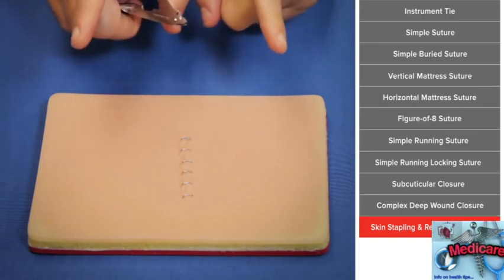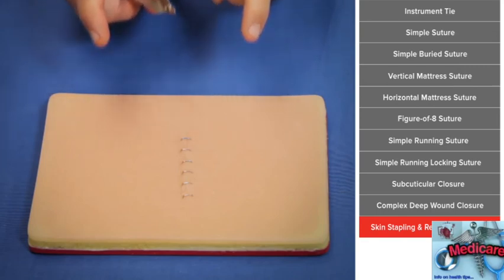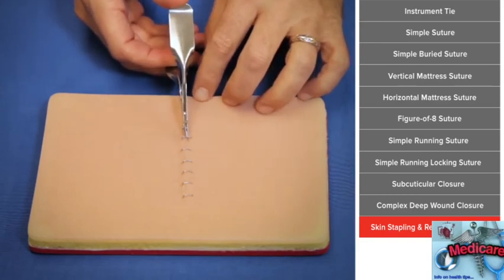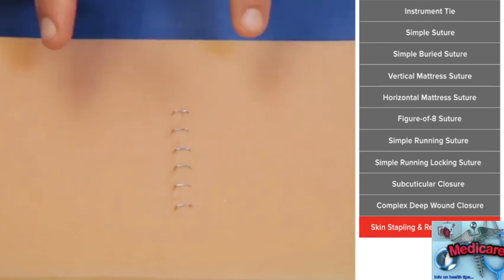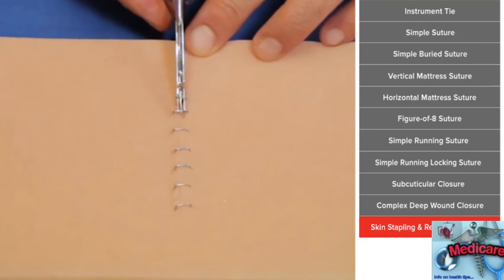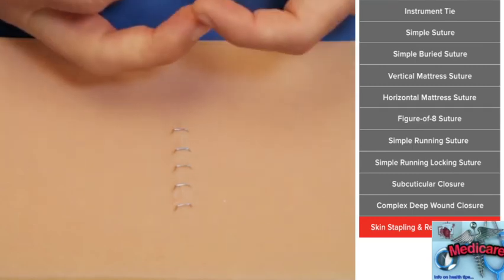Well, how do we take these out? This is a staple remover. Basically, it'll grab the staple, which has turned its edges in to approximate, and will open the edges of the staple, and then it'll straighten them so they pull right out. And so here you see as you push down on the staple remover, it unbends those ends of the staple. It aligns them so now they become straight, and then the staple will literally simply lift out of the wound, very simply. So we push down, spreads it, and as it straightens it, it just pops straight up.